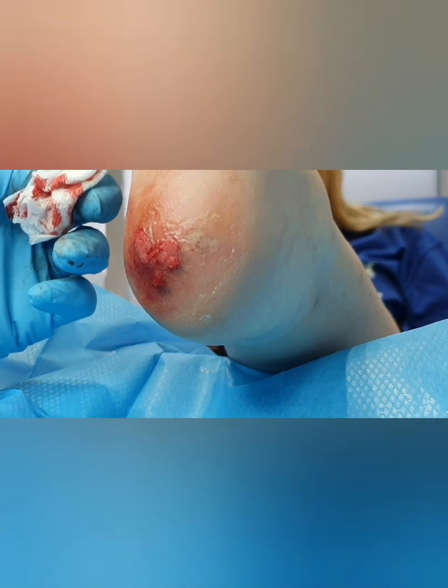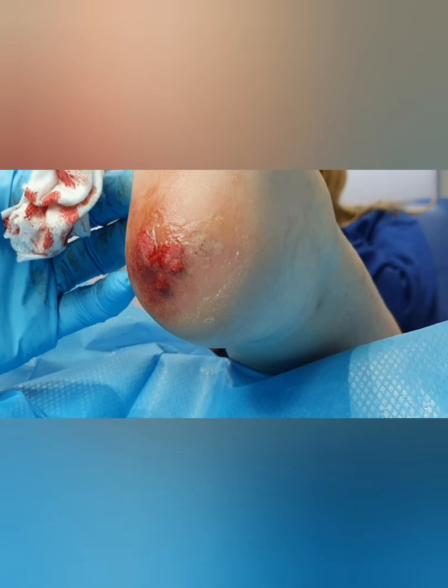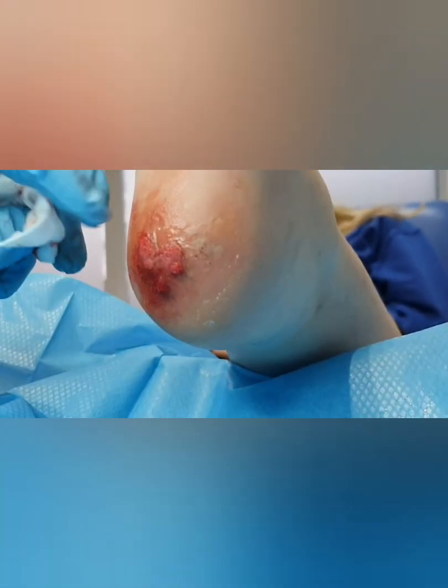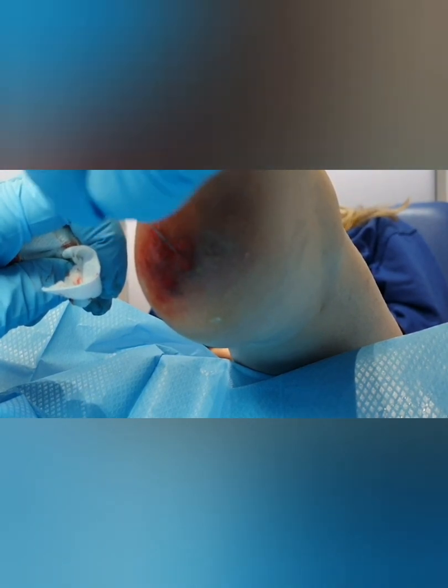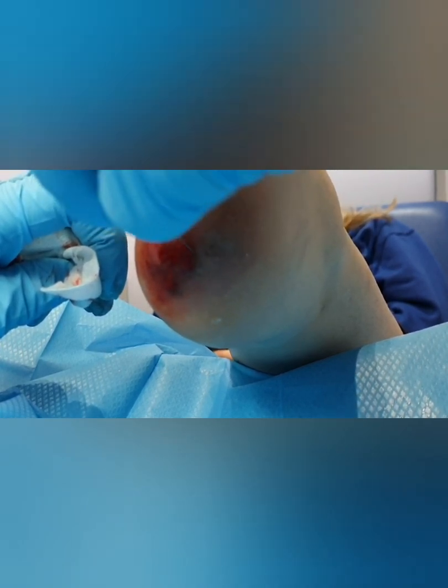So you can see now that that's looking far more like what we're wanting. It's starting to protrude a bit. It's looking quite beefy. There's not as much resistance when I'm passing the needle through it. So we're getting there now, we're getting there.